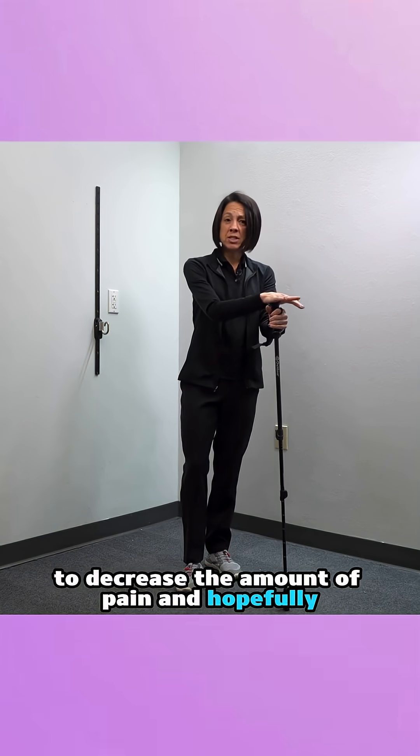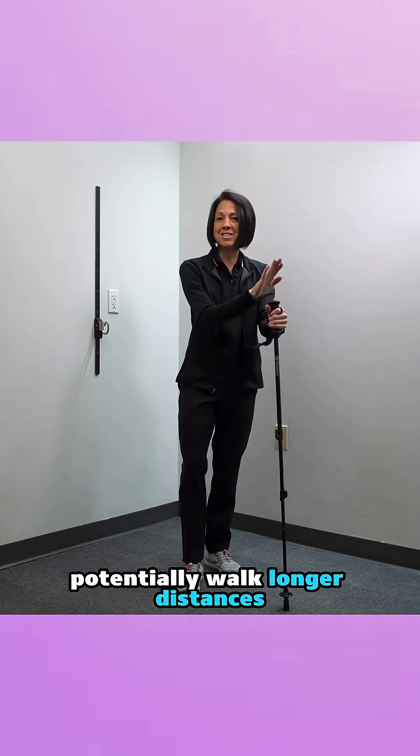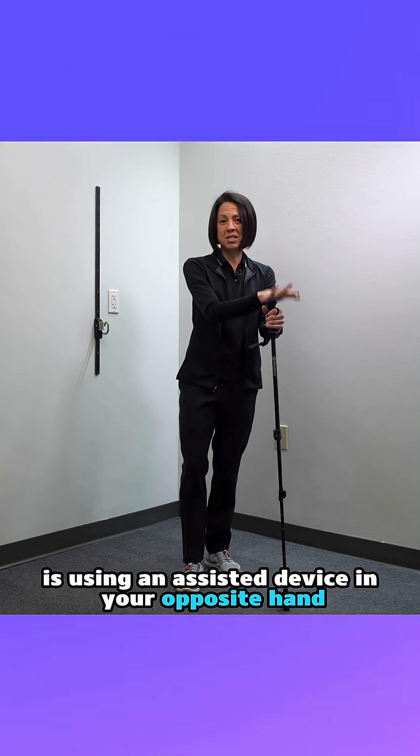So number one modification you can make if you have knee arthritis that is painful — to decrease the amount of pain and hopefully walk longer distances — is using an assistive device in your opposite hand.